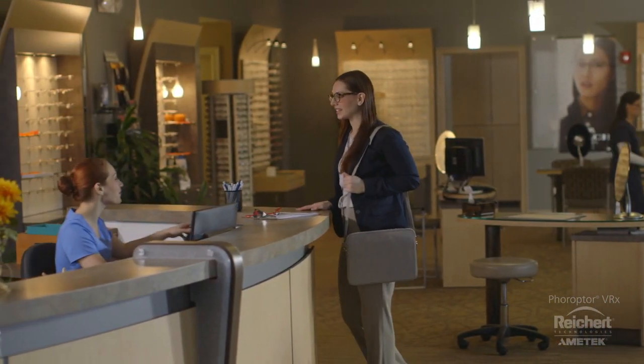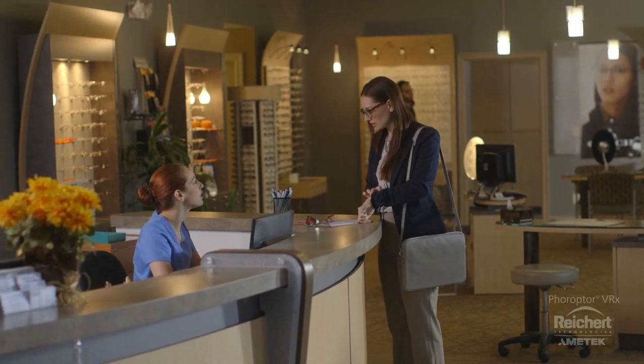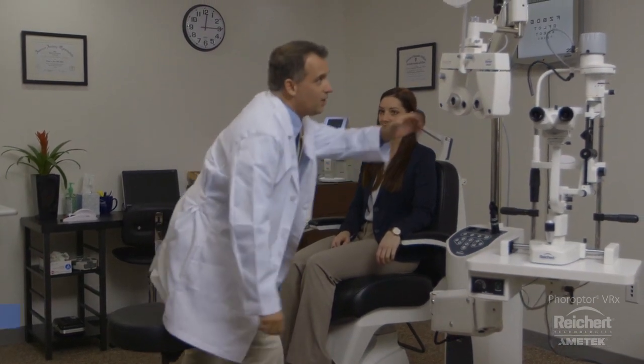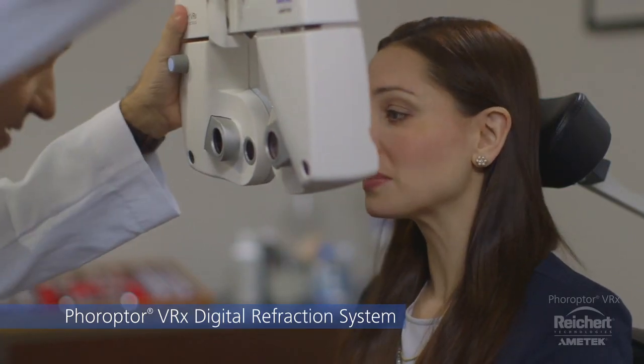Lakefront Eye Care is busier than ever and Dr. Jacobs understands that his patients are always in a rush. Time is of the essence. Drive practice efficiency and improve your patient's experience with the speed of the Reichert Phoroptor VRx digital refraction system.